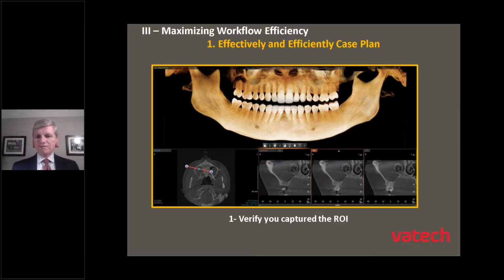Number one, verify that you captured the region of interest, ROI. Number two, verify the CBCT is diagnostic.